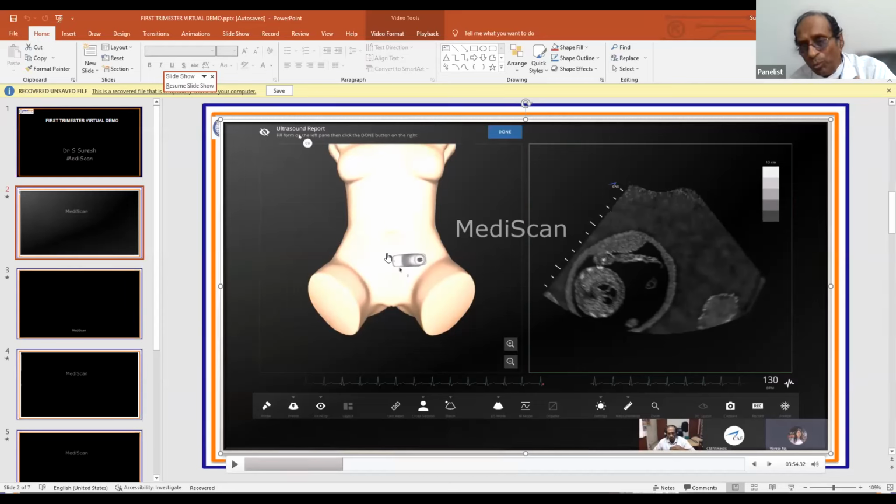What should I do to get the longitudinal axis of the spine? You control the spine of the baby, you control all parts of the baby. Very easy. So you need to do a good sagittal view of the spine from the cervical spine to the sacral spine, and that is what you should practice. From the sagittal spine, if you want to get the abdominal circumference, you move to the coronal view, then rotate 90 degrees.